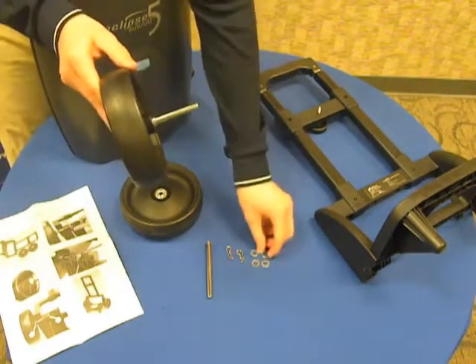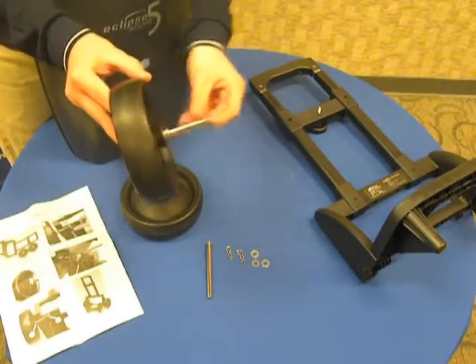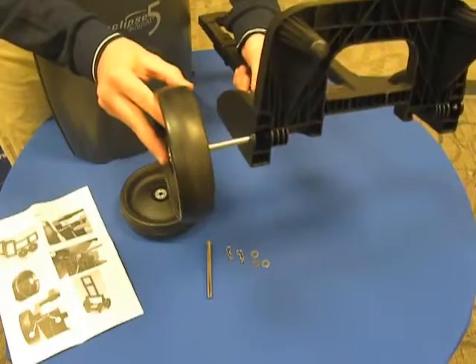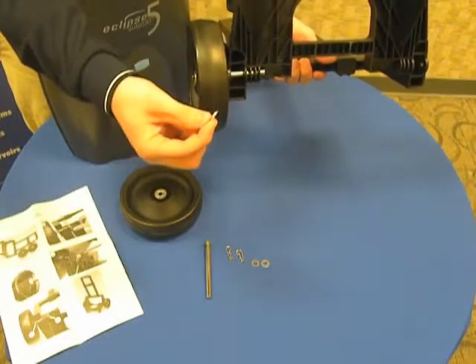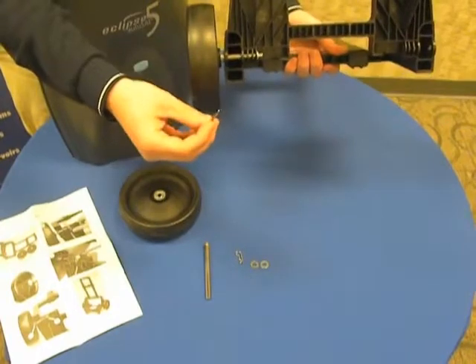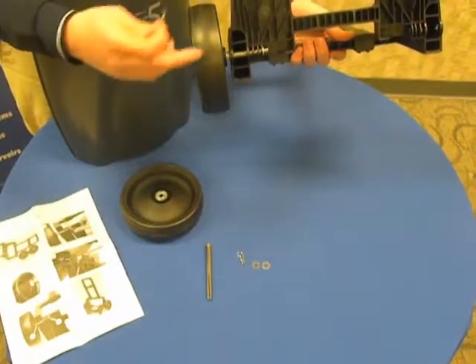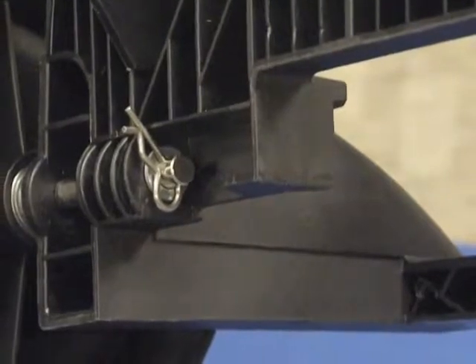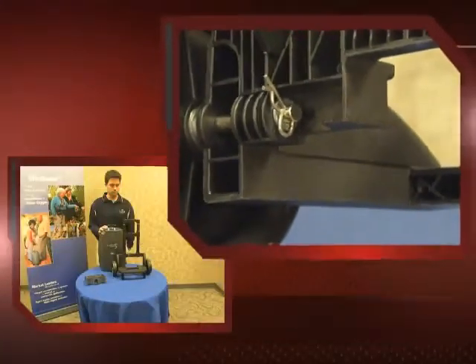At this point, you'll also want to install another washer on this end of the wheel. And at this point, you're ready to insert it onto the Eclipse. Okay, now we have the wheel inserted onto the cart. At this point, we'll take the second washer for this side and insert it on the end of the axle rod. And now you'll take your cotter pin and look for the hole on the axle rod, and secure the cotter pin through that hole to lock the wheel in place. And now your cart wheel is fully assembled. Go ahead now and repeat the same procedure with the second wheel.